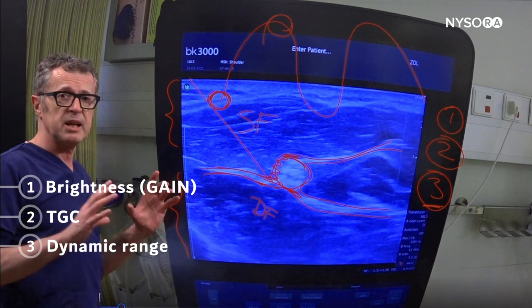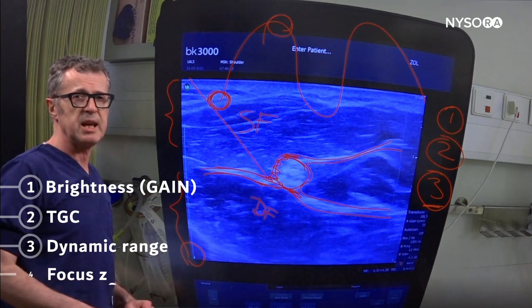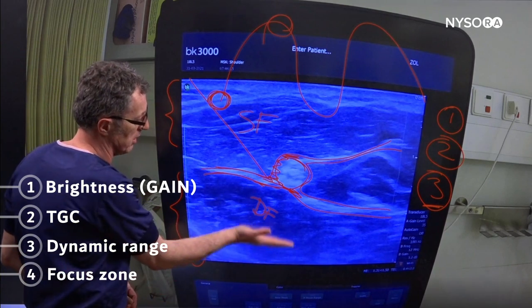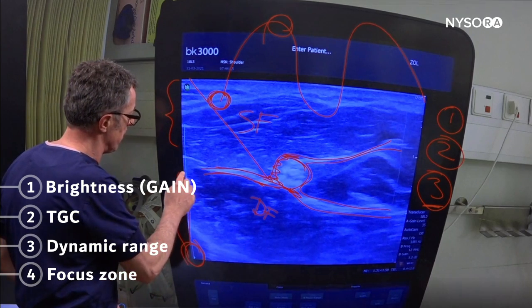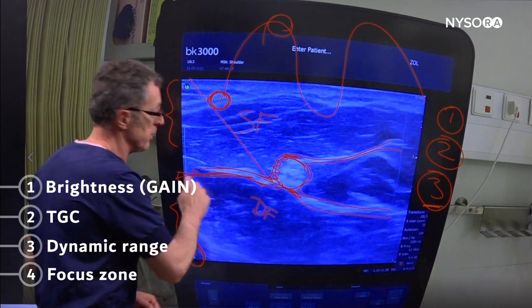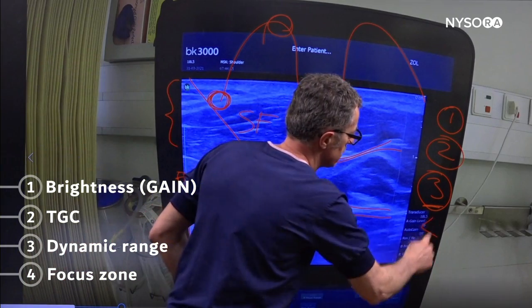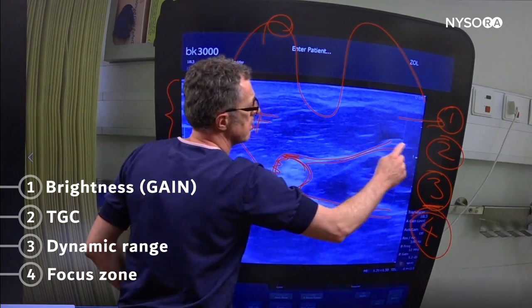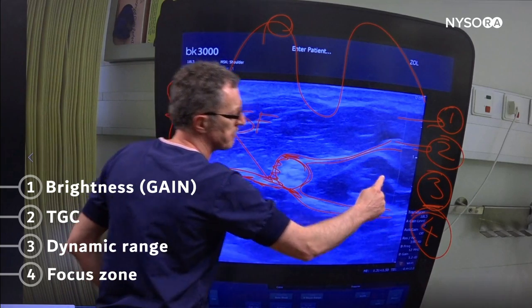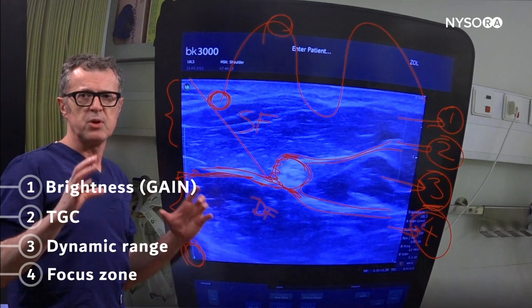Finally, the fourth adjustment: on this image the focus point is below the level of our anatomical interest, so we would like to raise it to the level of the structure of interest. Those are the four adjustments I'll guide you through: overall gain, time gain compensation, dynamic range, and the focus zone.